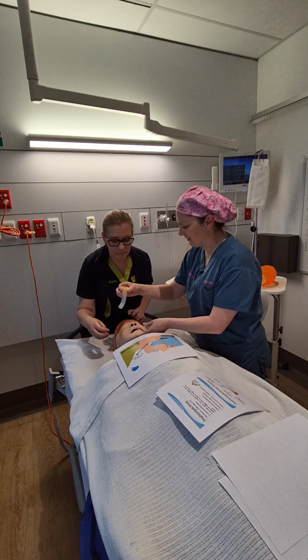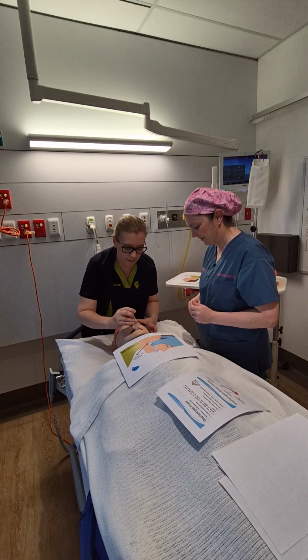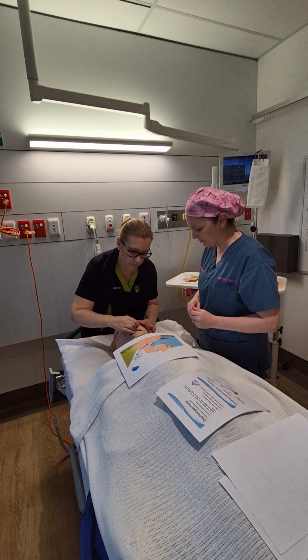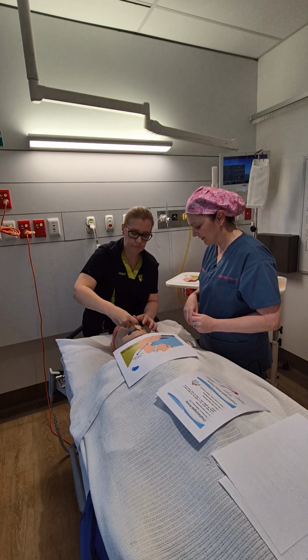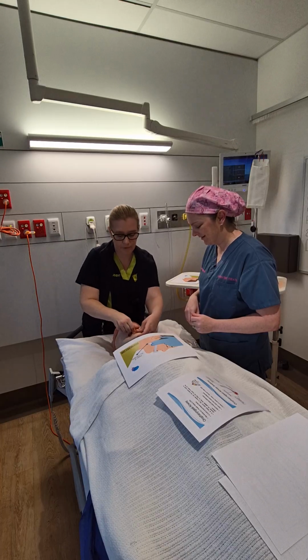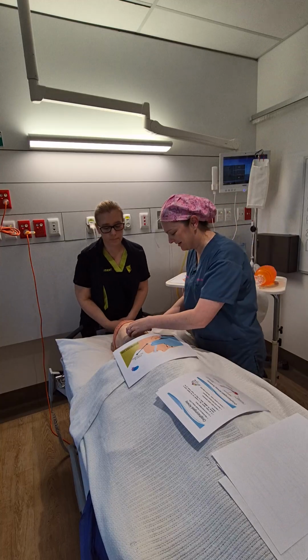Let's pull it out. Excellent. So pop it in upside down. Just making sure it's the right way. Yes. Wonderful. Push the tongue out the way. Excellent. Much more confident this time. Good job. And twist it. Oh no, you're right. Okay. Yeah. Wonderful. Good job. Nice work. All right.